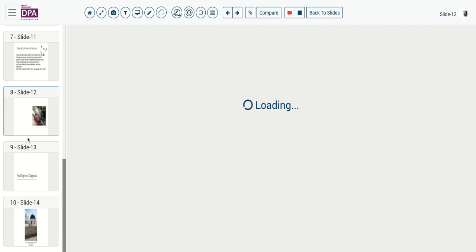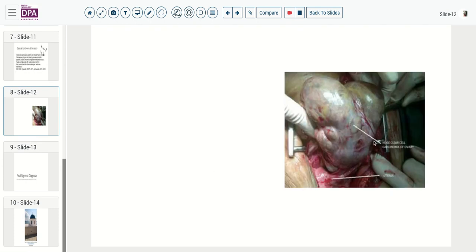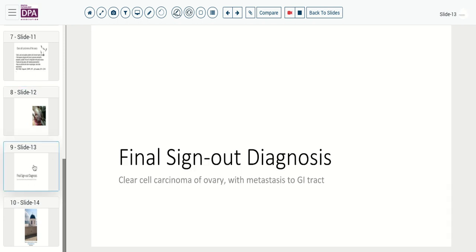Grossly, as might be expected, these tend to be fairly solid cystic type tumors. They don't have the same penchant for surface involvement as serous tumors, but certainly if there's pre-op or intraoperative rupture, peritoneal spread is a possible concern. Our final sign-out diagnosis is clear cell carcinoma of the ovary with metastasis to the GI tract as well as to the fallopian tubes.